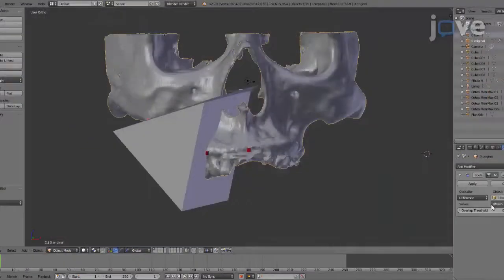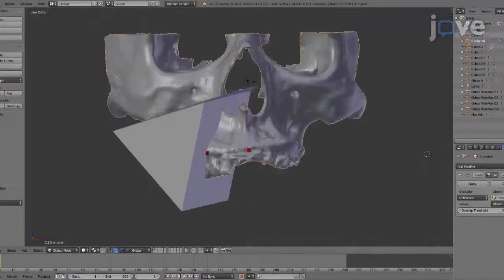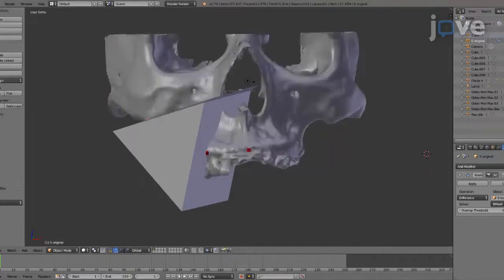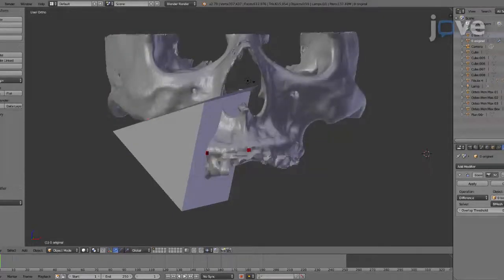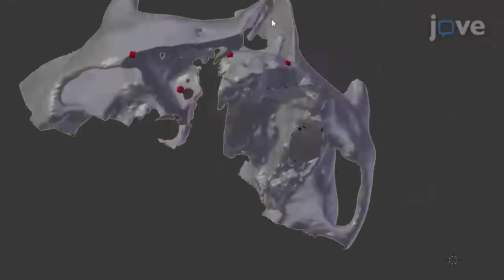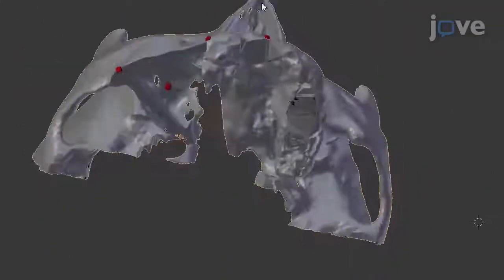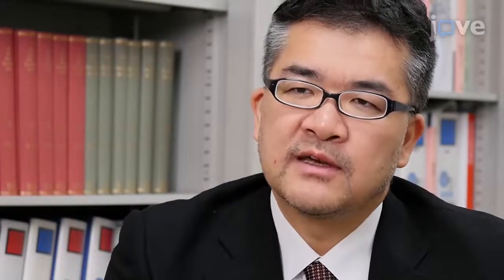Then use a Boolean modifier to subtract the resectable solid from the facial bone to generate a shaved facial bone for the maxillary defect model. Boolean modifiers sometimes fail. If this happens, don't panic and try again.